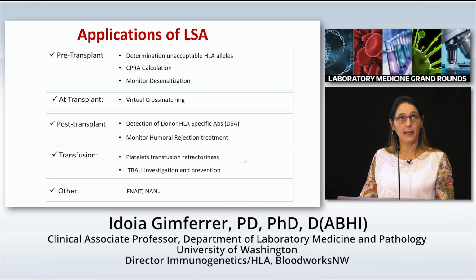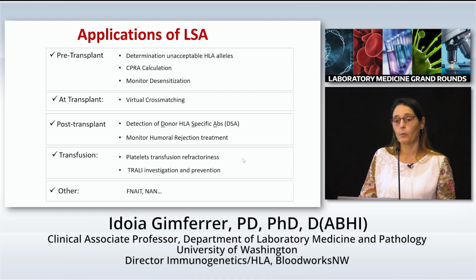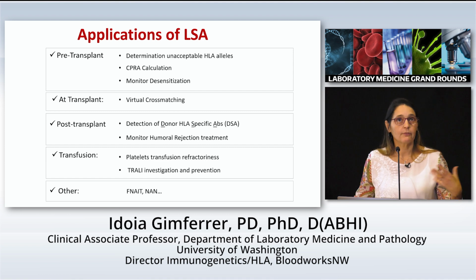So as you can see, LSA is the assay that we mainly do in the laboratory. We do about 1,000 runs per month. That is a lot, because they have to be analyzed by hand, usually, and the directors are the only ones allowed to do this analysis. So myself and the co-director, we are the ones doing that during the week. So we do a lot of them. And it's good because you get familiar with the pattern.